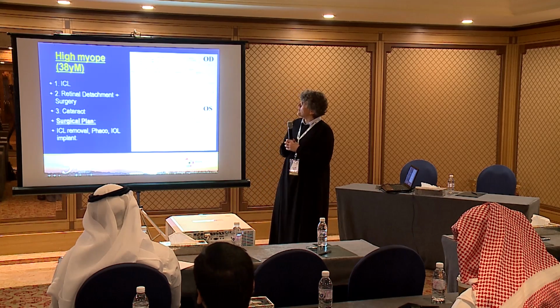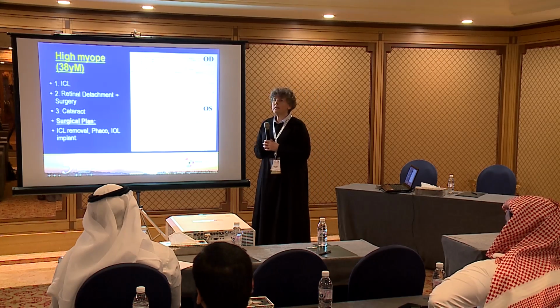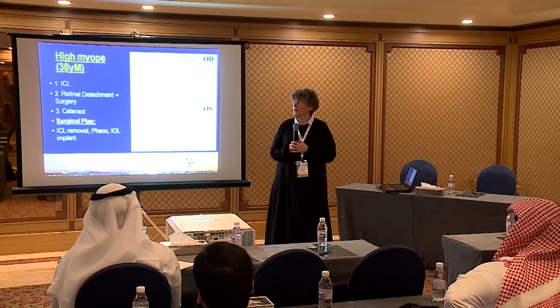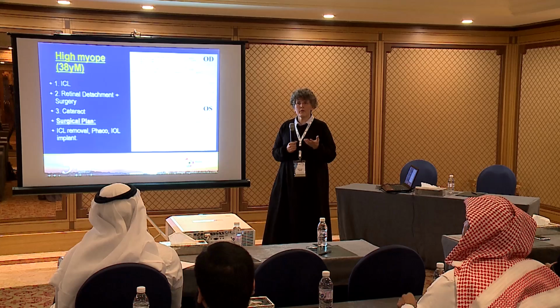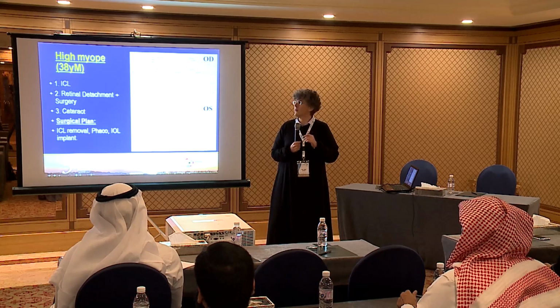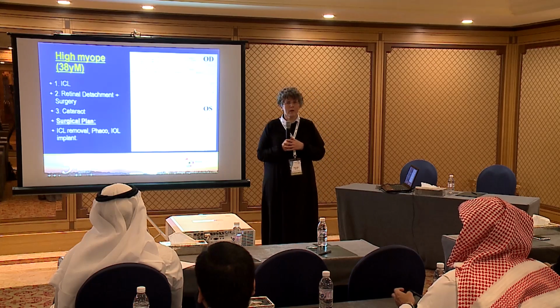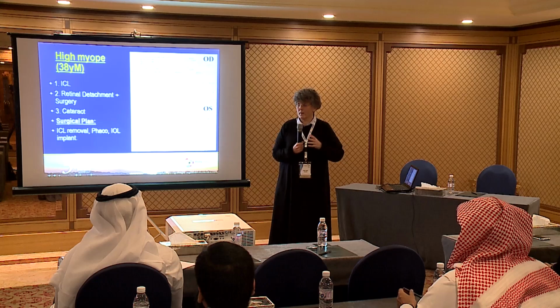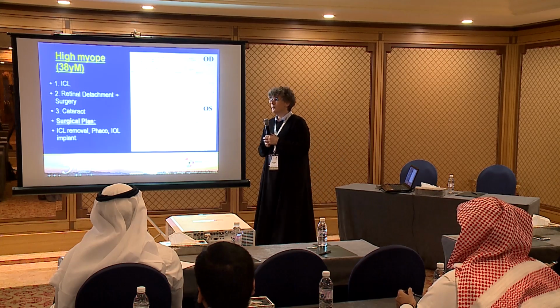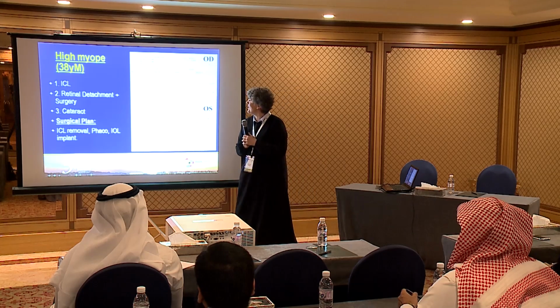Now this man was a 38-year myope, and he had an ICL put in by someone else. After that, he's a myope, so they still get retinal detachments. He had a vitrectomy, and after the vitrectomy, with the ICL in place, he got a cataract and needed to go out. This patient was young, and he said, oh, I want you to take out the cataract and put in a multifocal IOL. Now, we don't make our lives ourselves. I don't need to tell you, you know, it's not in our hands.